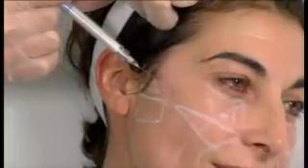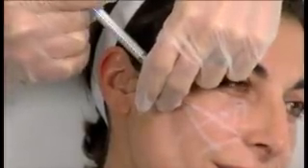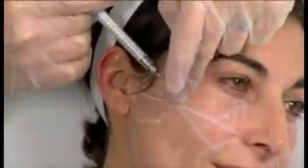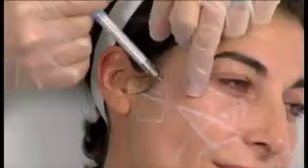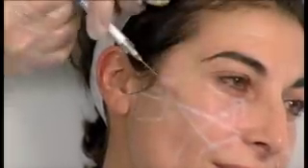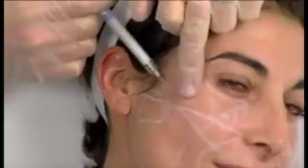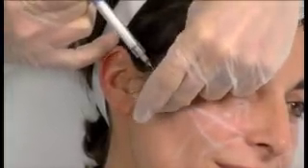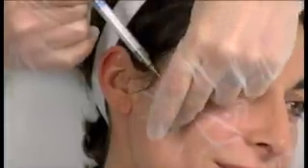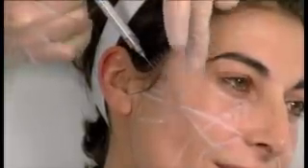And I talked about the Besant's study about the mobile zones and the fixed zones in the face, and what he has actually shown us in that study is that this area underneath the eye, actually the orbicularis muscle where it inserts into the skin, is a very, very important target area for repositioning. Now, I'm making different strands in a fanning technique. I have to go back down to the periosteum, and there we go. So I'm underneath the fat compartments, and I want to be underneath the fat compartments if I want to lift them. Also, you might notice that when I'm far away from my injection site, from my entry point, I put more pressure on my plunger, and as soon as I come back to the entrance site, then I put less pressure on my plunger.